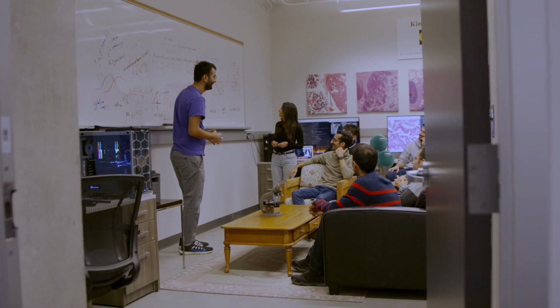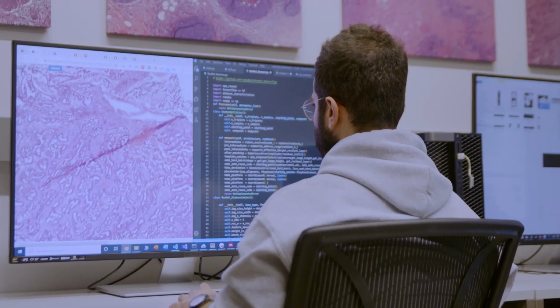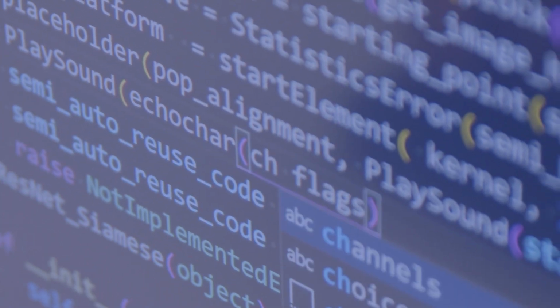So what we did, we look at the so-called deep features, which are again some numbers that AI calculates for each image, and we save them as barcodes. Going toward barcodes makes it possible to tag and find histopathology images in a very short time. A file with 1 gigabyte could be reduced to 5 to 10 kilobyte of information.